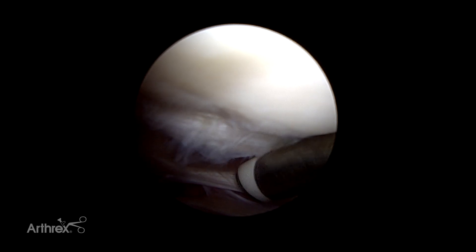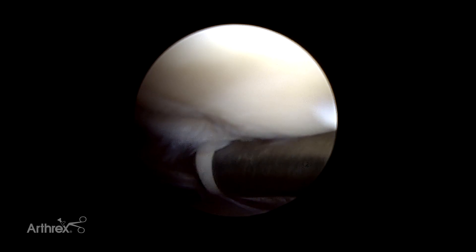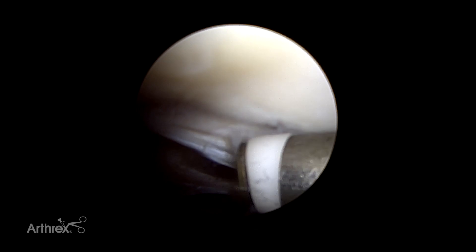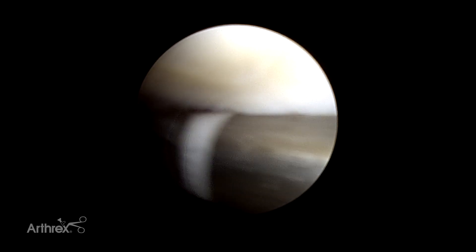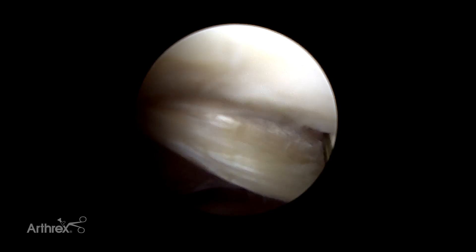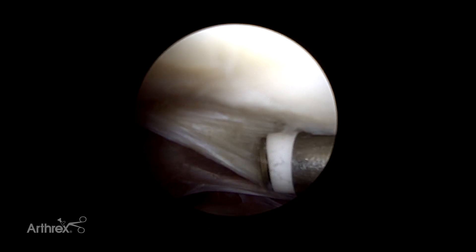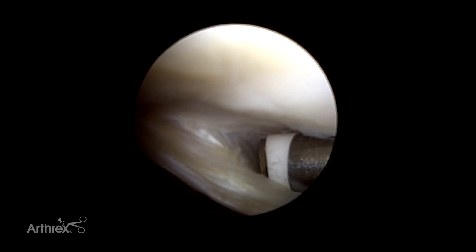You can see how the edge is literally cutting the ligament. But at the same time, if I didn't want to cut the ligament — say it was just hypertrophied, thick, and frayed — I can use my coag. And if you watch when I see these frayed edges, I can literally just use my coag and it will get rid of the frayed edges without really damaging the fibers, because you can see the fibers are staying perfectly nice.